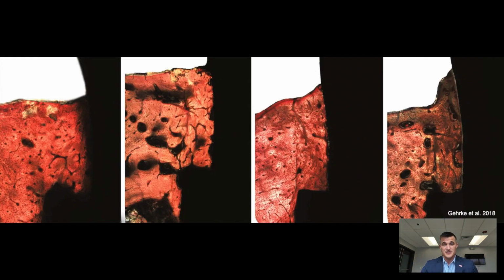And more than the study and the conclusion of the study, this histological slide is very important to the story of the PROS concepts. Because when I saw this image, it made it very clear to me that there is a recipe that you can follow to have very high bone levels. Because this study histologically shows in these images bone depositing on the platform, on the abutment of these implants. So bone levels above the platform, deposited on the abutment of these implants.